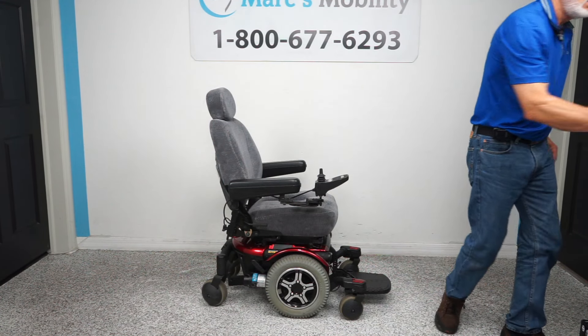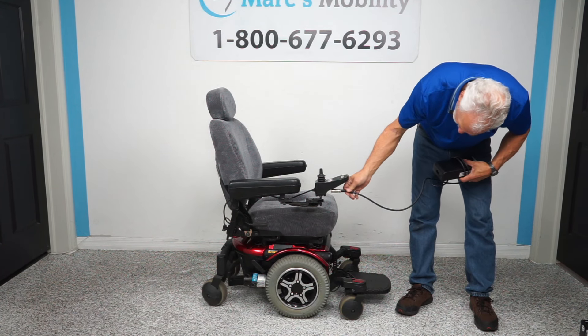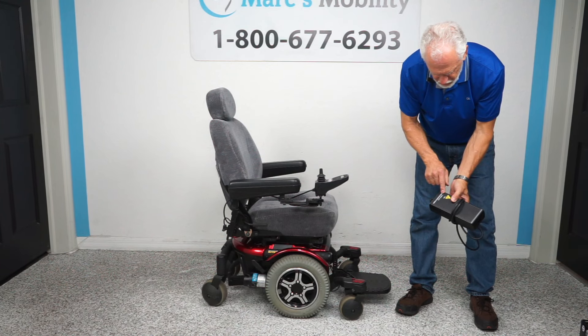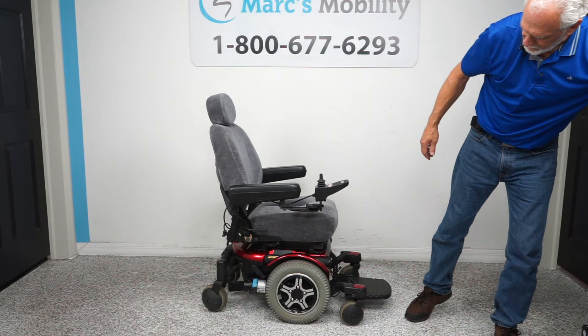When you charge this chair, you take the charger that comes with the chair — we'll use this one as an example — and plug it right here. As soon as the light goes from red to green, you're fully charged.